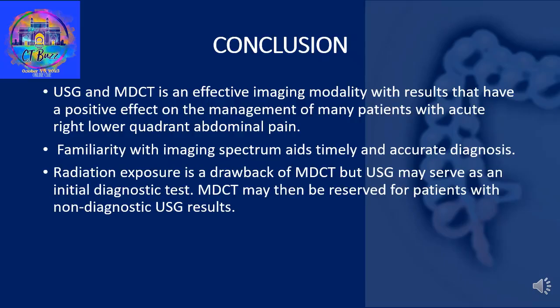Familiarity with the imaging spectrum aids timely and accurate diagnosis. Radiation exposure is a drawback of CT, but ultrasound may serve as an initial diagnostic test, followed by CT reserved for patients with non-diagnostic ultrasound results.